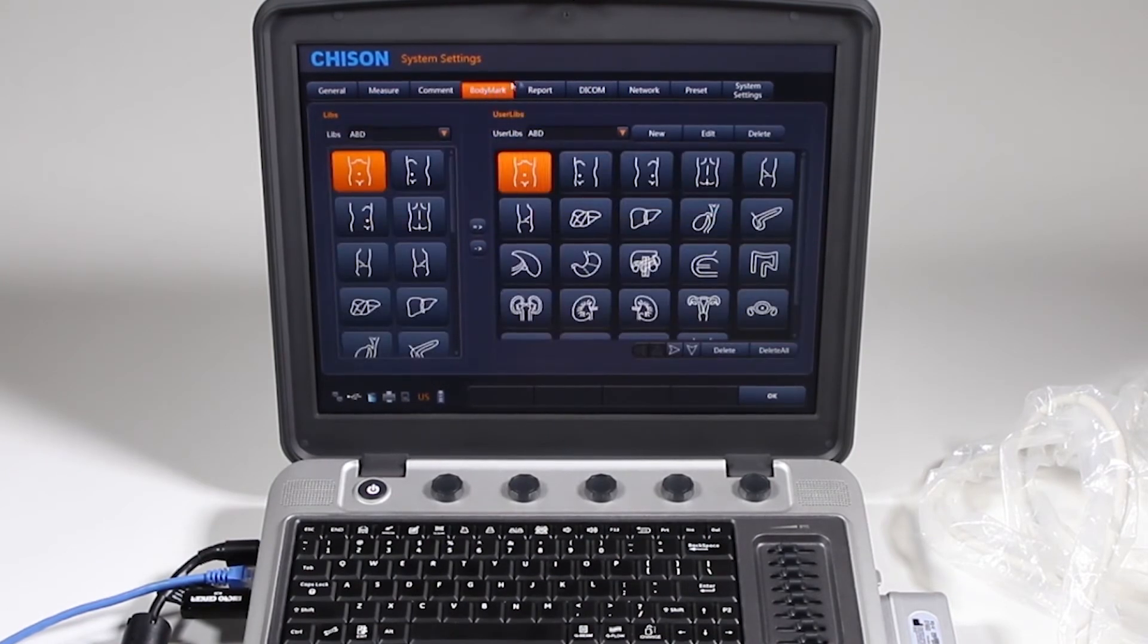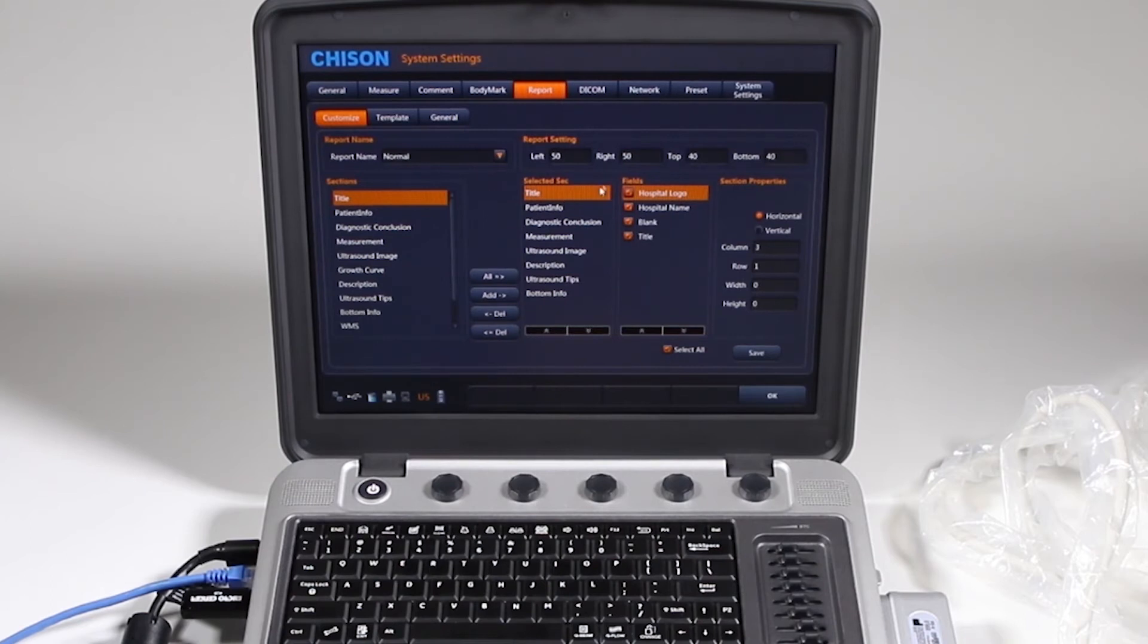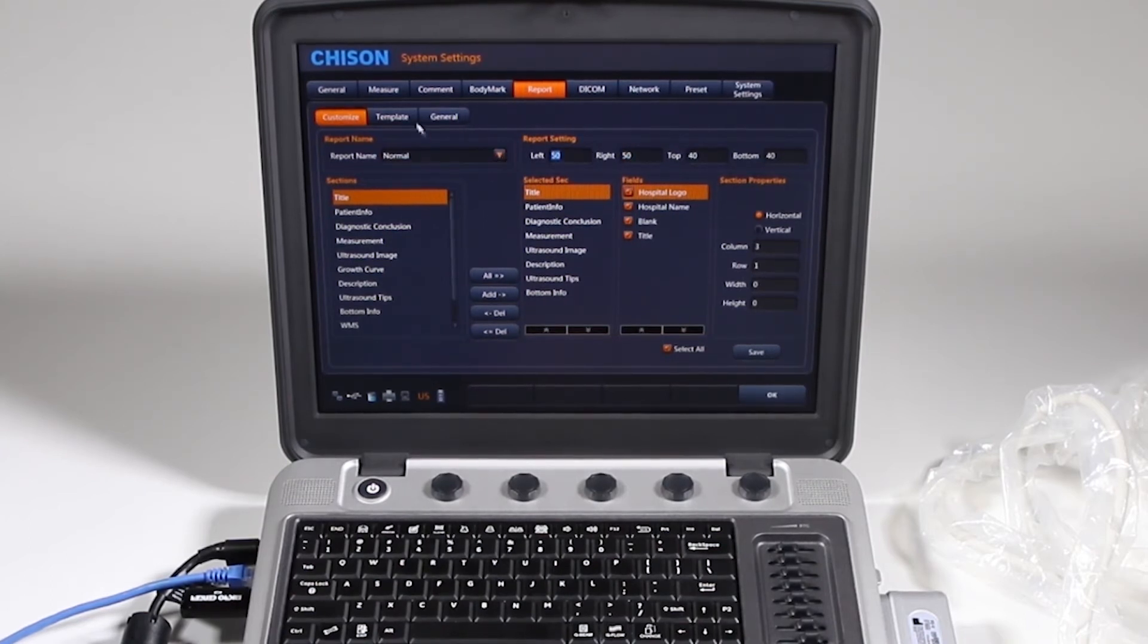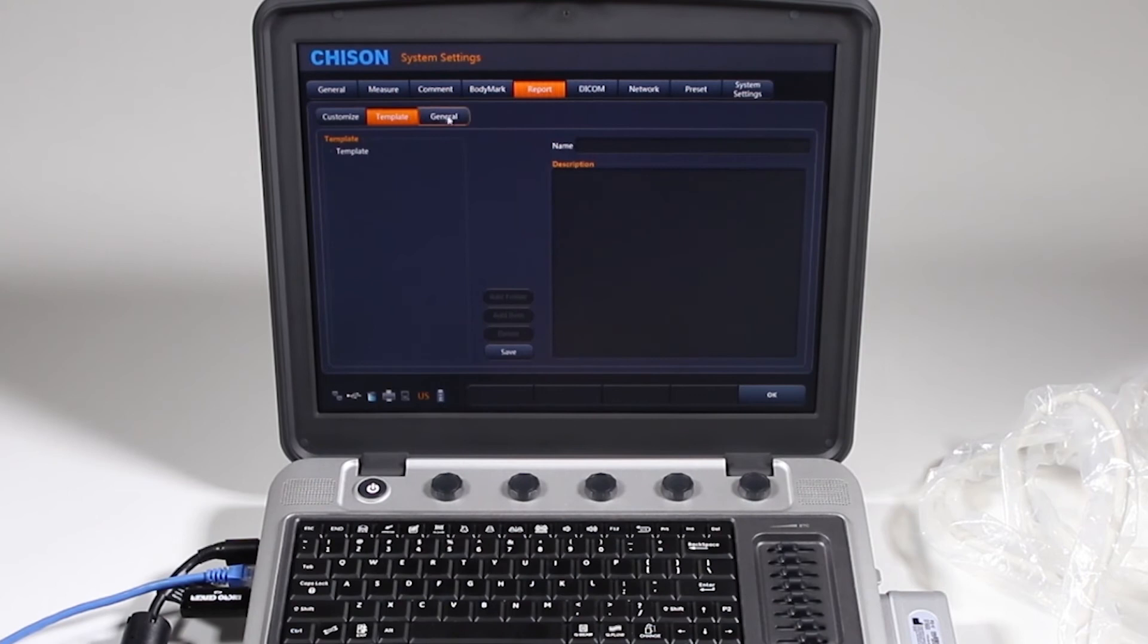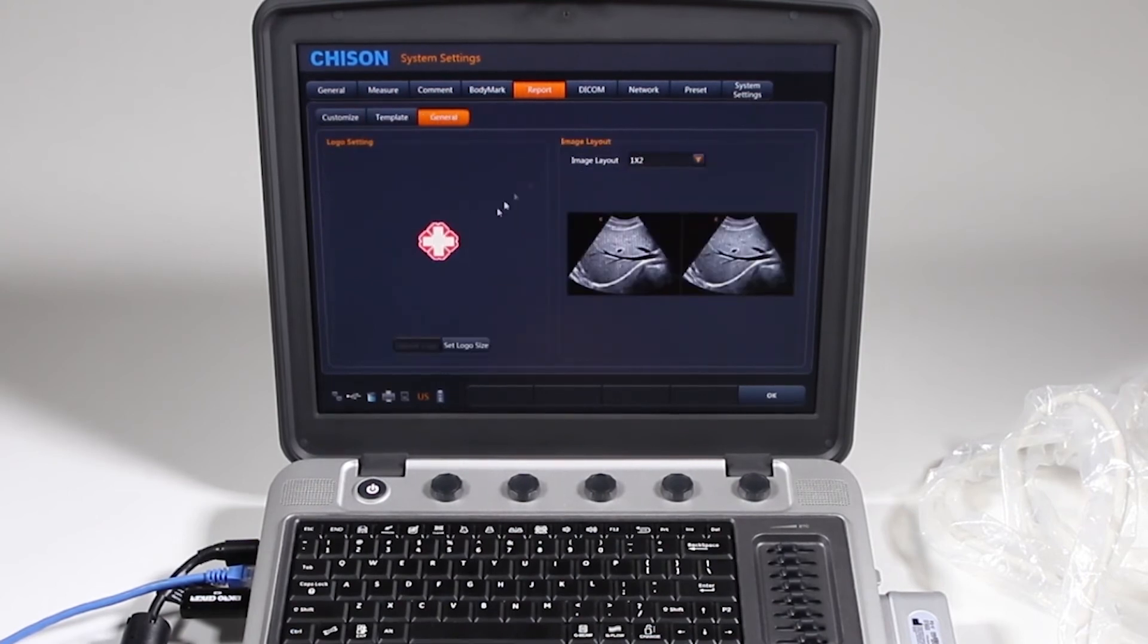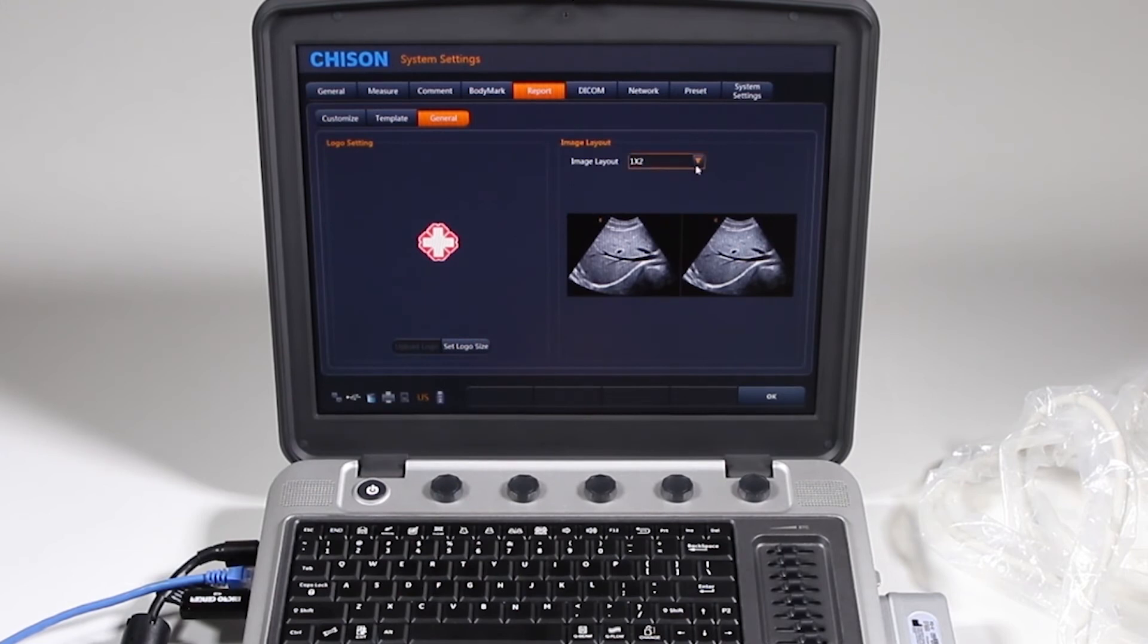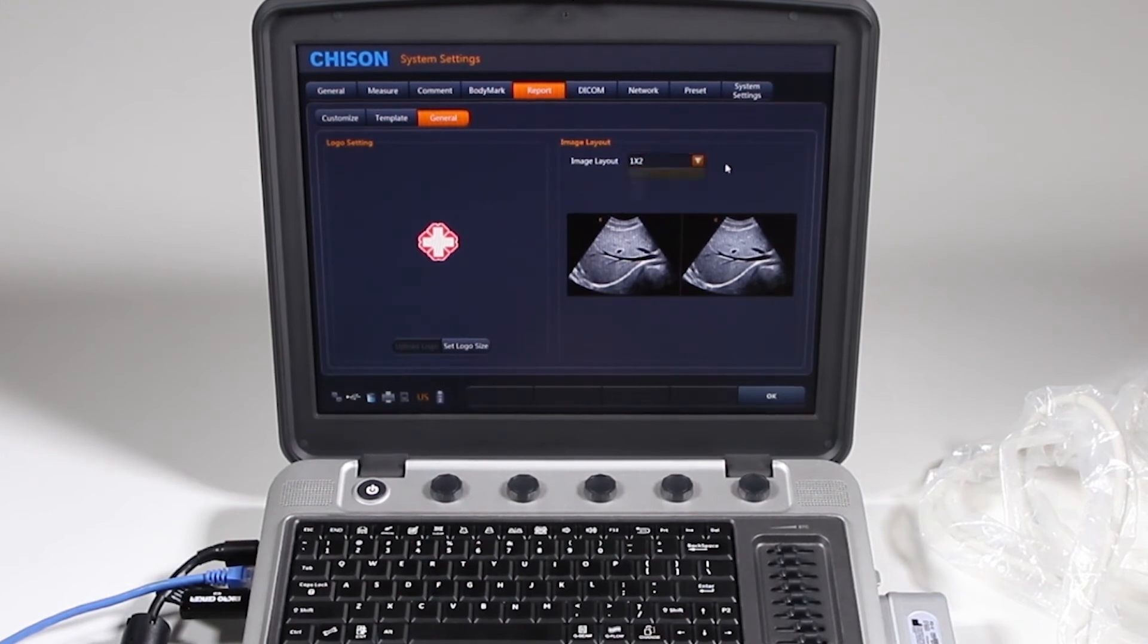Body markers work very much the same way. You report, here are the items you can add or remove to your report, and obviously there's some custom things you can do here. Templates I'm not going to get into, and general, you can add your own logo here, and update it then, and this is how you want the image layout to be on your report.